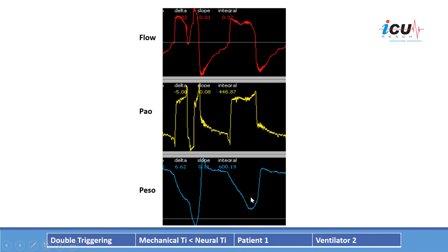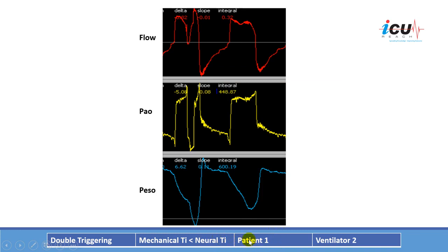The second breath shown here represents one patient breath — you can see the patient's negative inspiratory effort resulting in negative pressure, producing only one breath. When the inspiratory time is adjusted to accommodate the patient's need, this resolves. Double triggering occurs because the mechanical inspiratory time is less than the neural inspiratory time, resulting in one patient breath and two ventilator breaths.